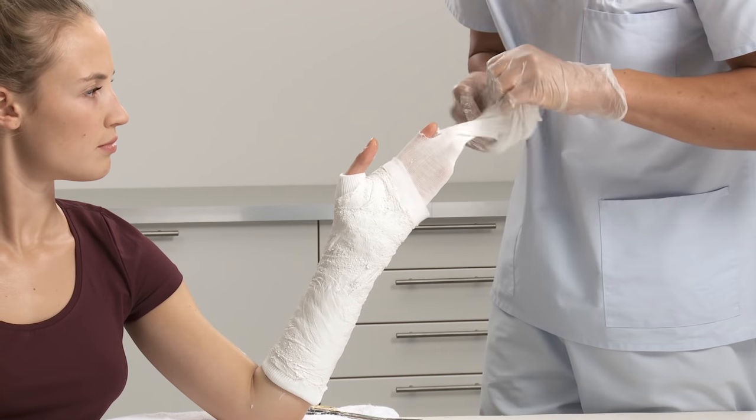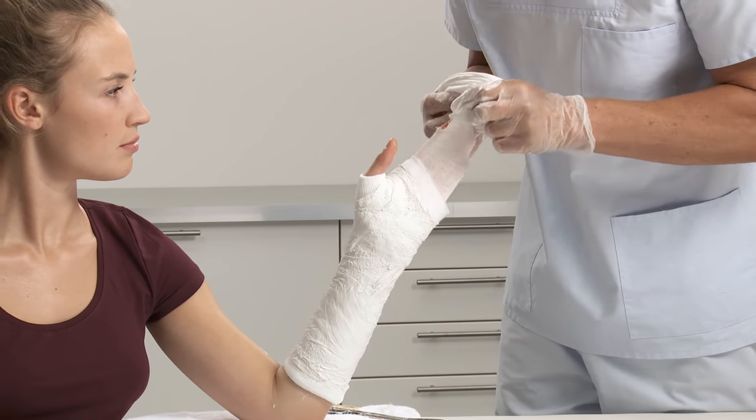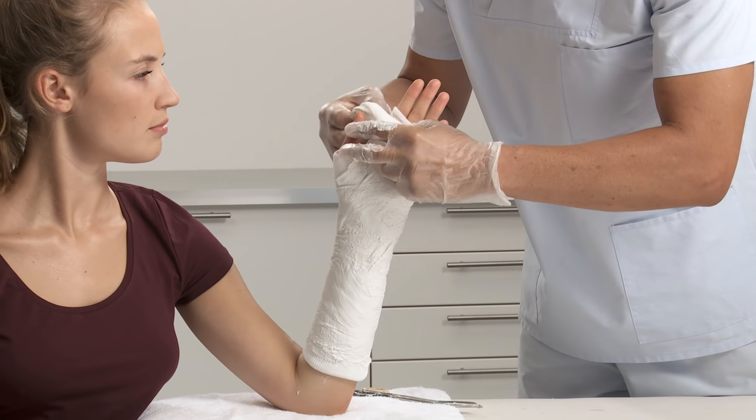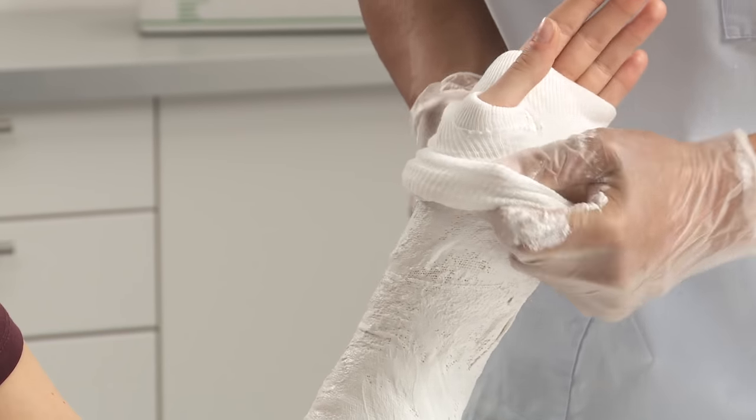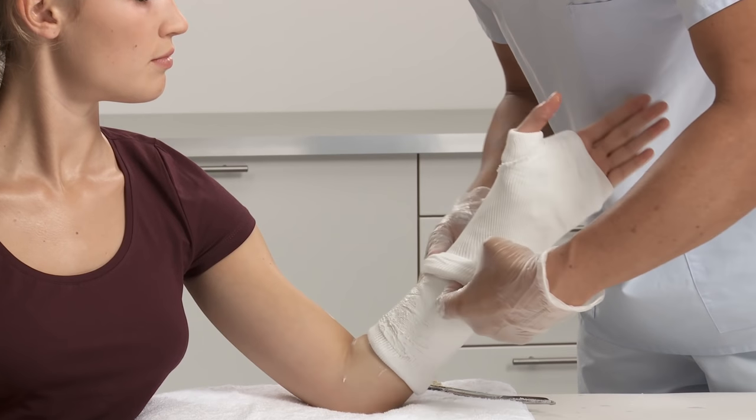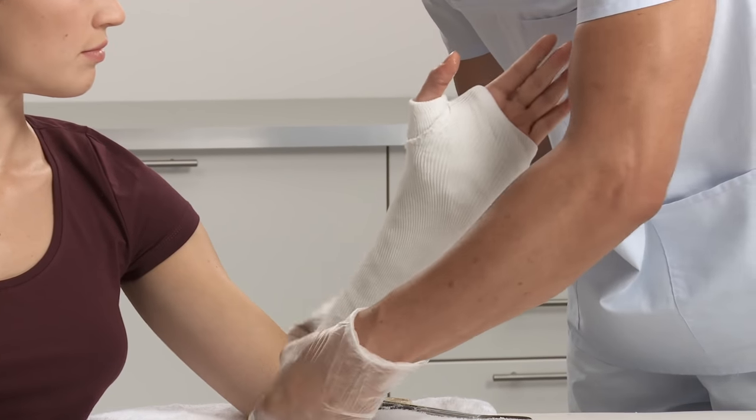Pull over the remaining stockinette and smooth it down with the palm of your hands, molding the cast at the same time, making sure the wrist is kept in the right position. Cut off the remaining stockinette at the proximal end.